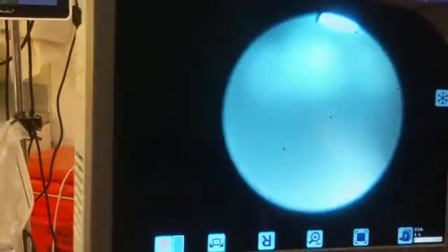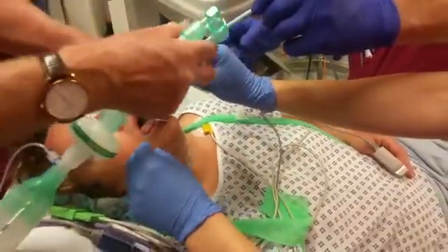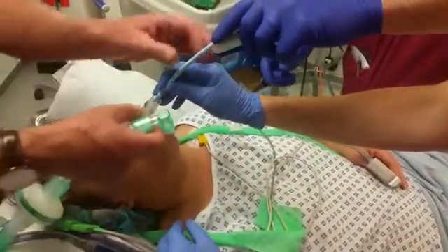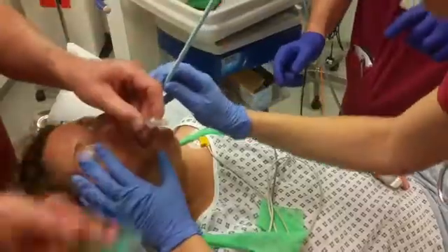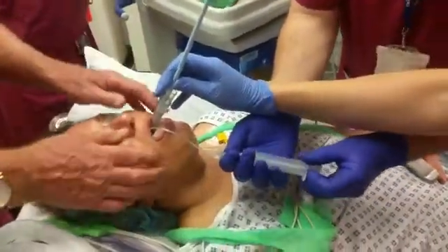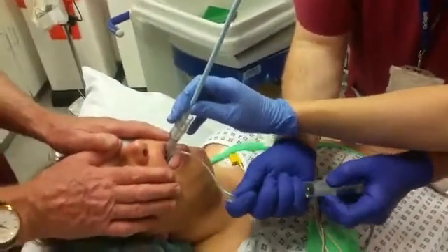I'm going to film this for now. Can we leave it out? We can't leave it, no of course. Well you're going to interrupt me over it, yeah? So Neil's going to take that out. Can I just unplate it? Yeah. Stephen, 50 mil syringe behind you. Sorry, I couldn't leave it.